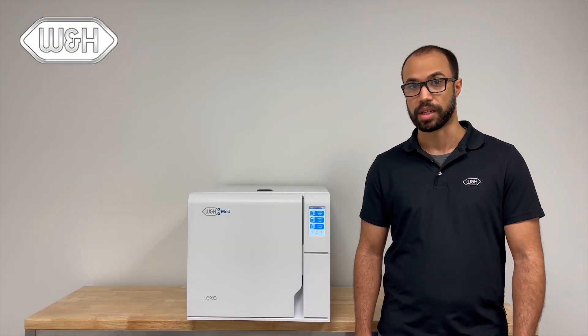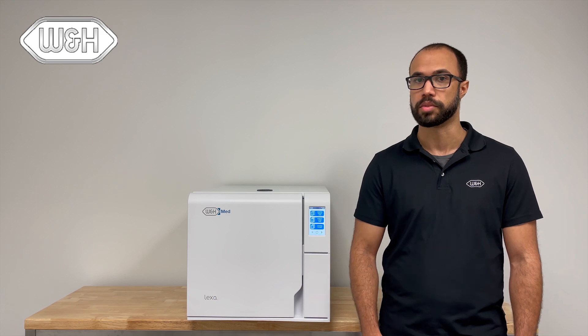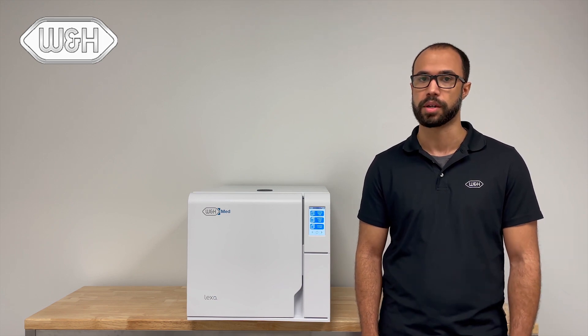The Lexa Sterilizer is a tabletop steam sterilizer with an 11-inch chamber and closed-door vacuum-assisted drying cycles for bone-dry loads.